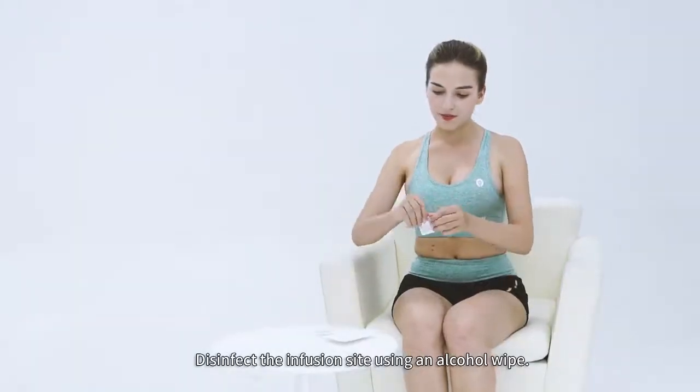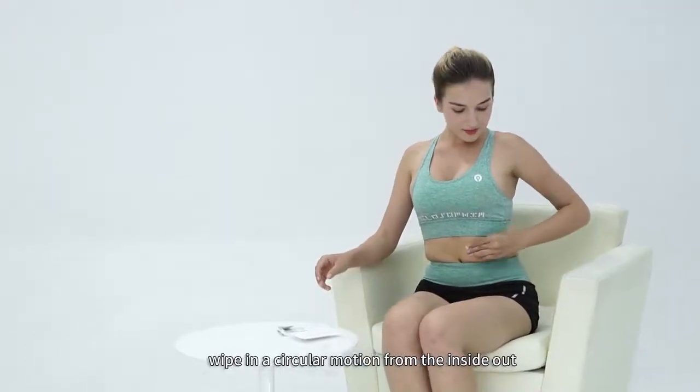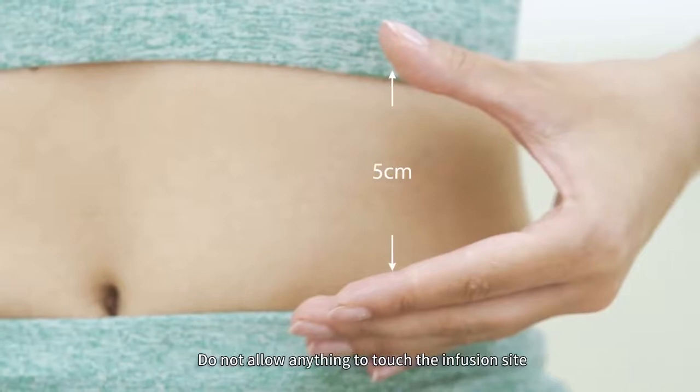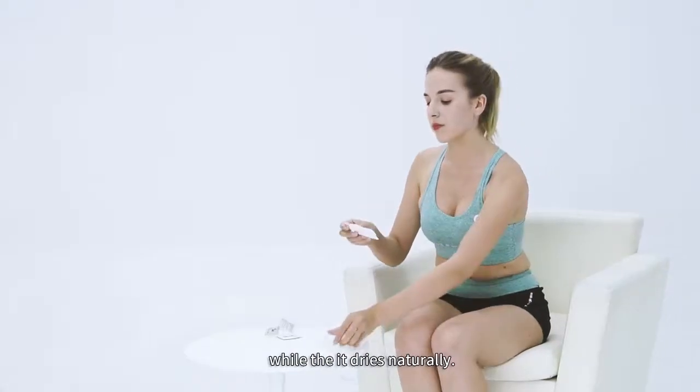Disinfect the infusion site using an alcohol wipe. Starting from the injection point, wipe in a circular motion from the inside out until you have made a circle of at least 5 centimeters in diameter. Do not allow anything to touch the infusion site while it dries naturally.